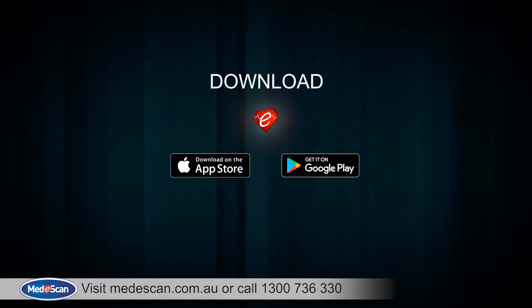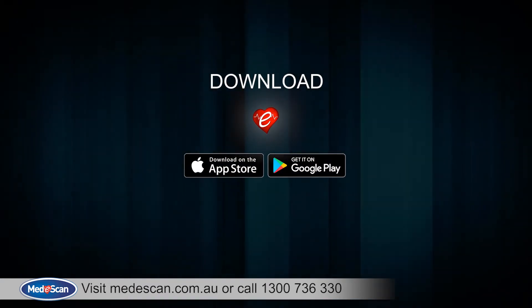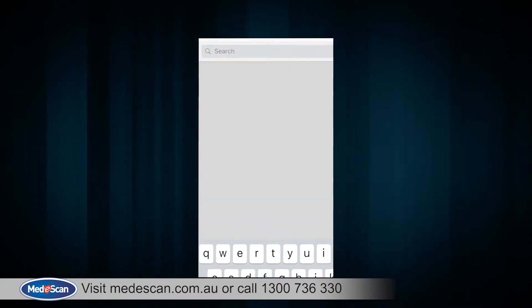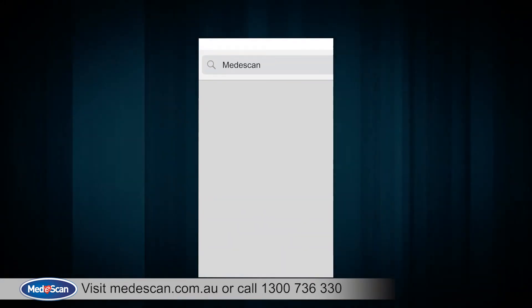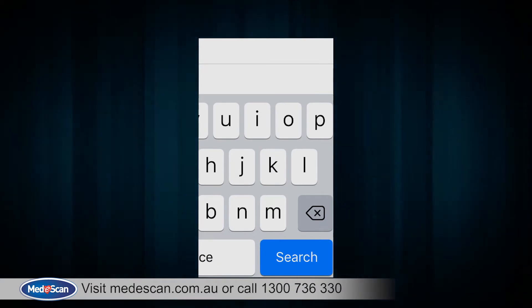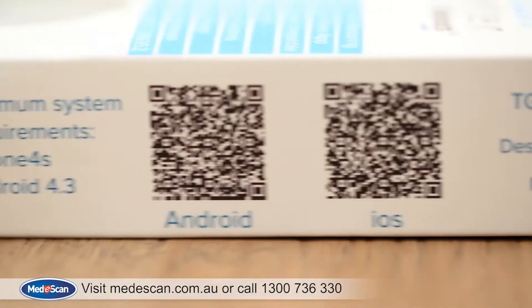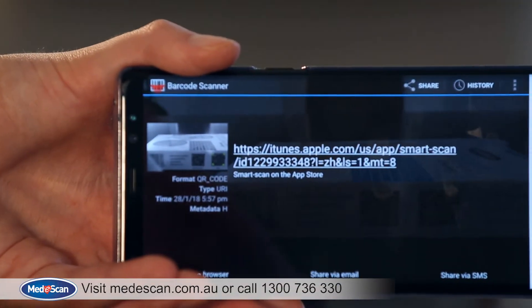Before we start, please download the SmartScan app. You can easily find the app on Google Play or the App Store by searching for MediScan or SmartScan thermometer. You can also reach the app by scanning the QR code available on the packaging.